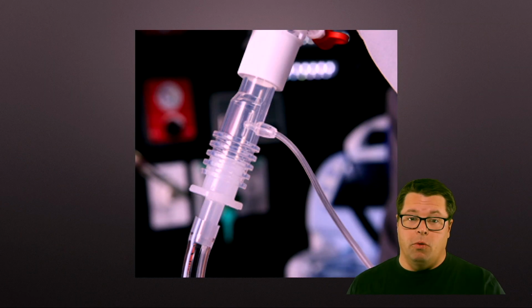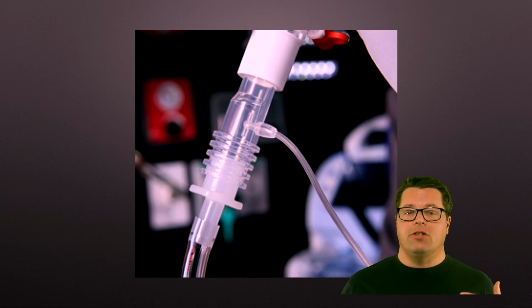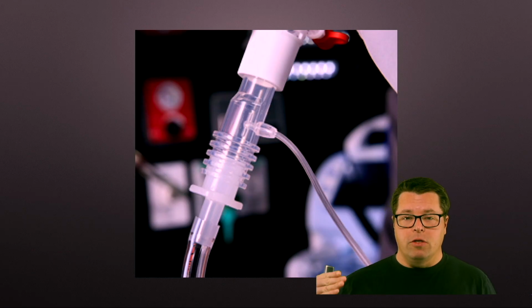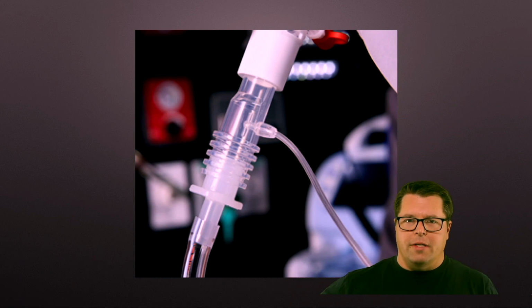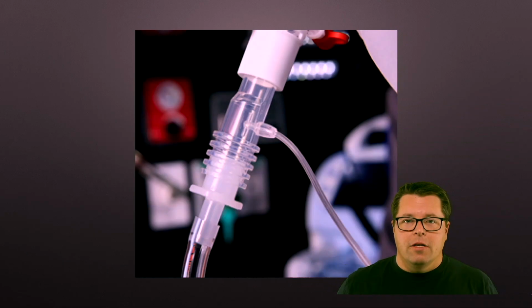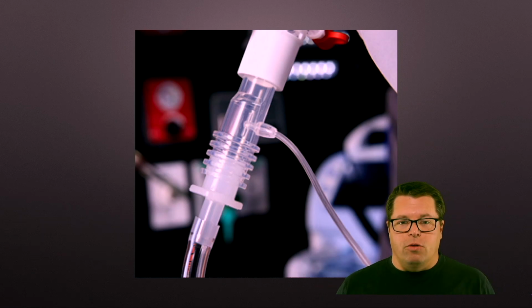One of the most visible ways that you'll see people use End Tidal CO2, and a really good way to use it, is to check confirmation of an advanced airway device. Although it doesn't have to be an advanced airway, it could just be any airway. And again, why? Because a good End Tidal CO2 measurement means that gas, carbon dioxide, has somehow made it from your blood up through your airways and out to the sensor itself, and theoretically out of the body. So there is, theoretically, a pathway between your blood and the atmosphere, which is what you're supposed to have. And so use as an airway confirmation device is super.